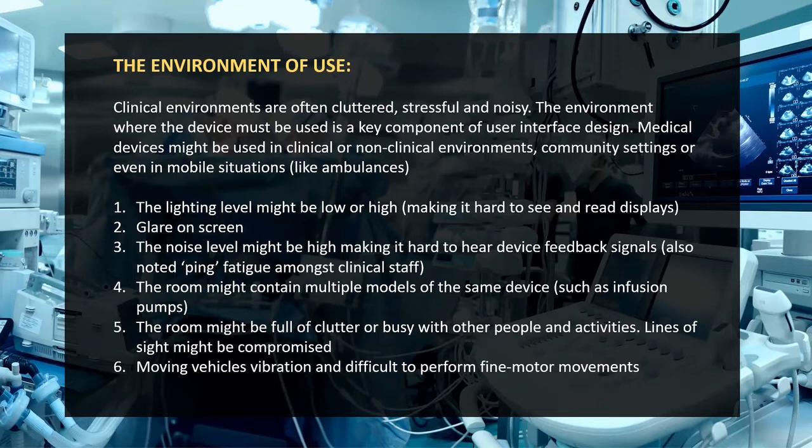Now, there's also a noted syndrome with clinical staff in that they get a car alarm sensitivity, where things go off and there's a ping fatigue amongst clinical staff. So there might be subtle changes in the way that the auditory signal is conveyed that makes attention and also distinctively identifies that device. There might be multiple models of the same device, such as a stack of infusion pumps, for instance, and you've got to make sure that yours is the one that gets noticed.